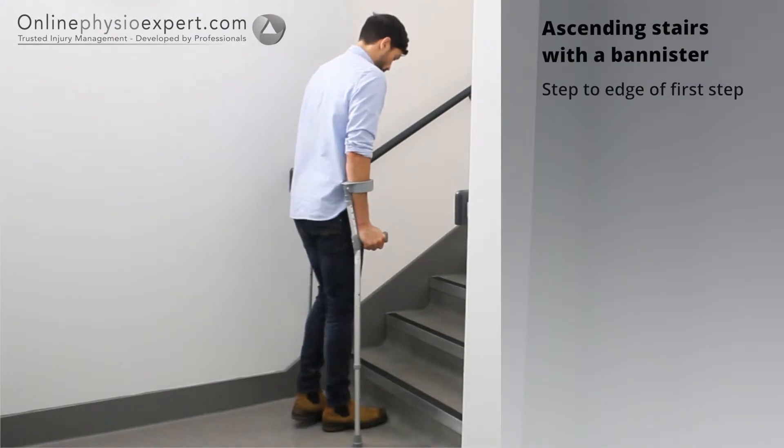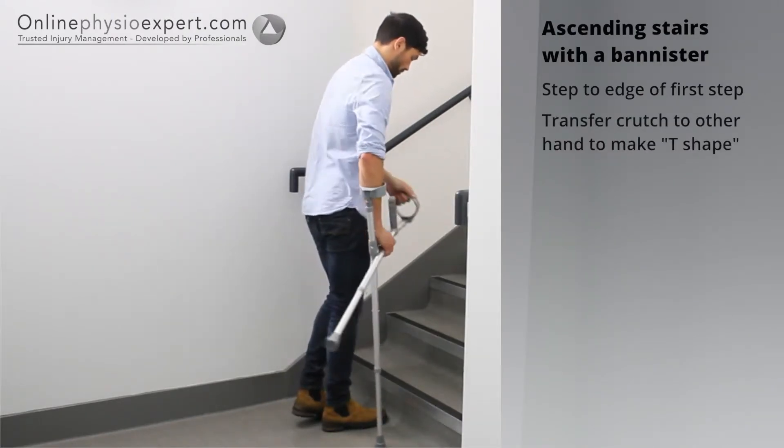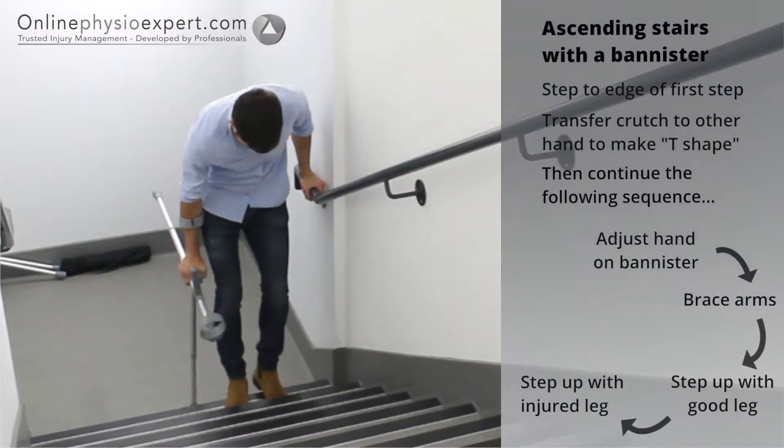To ascend stairs safely, step your feet to the edge of the first step. Transfer the crutch nearest the banister to your other hand and place your hand forwards on the banister. Step your non-injured leg to the next step followed by your injured leg.